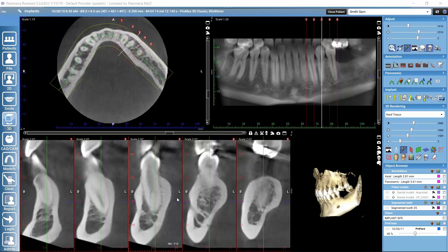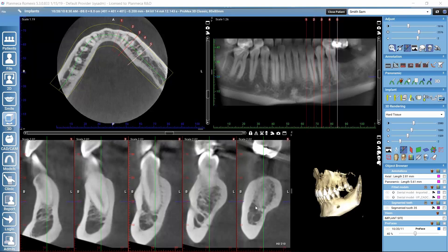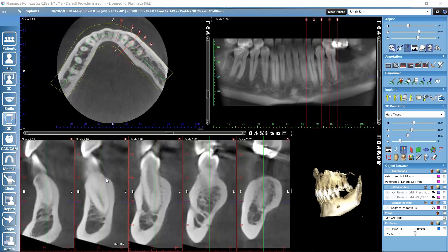Let's take a look at what kind of views we see in this sub-module. We have a panoramic view and an axial view. We can also generate the panoramic view here using the panoramic tools — for example, drawing on the axial view the plane according to which we'd like to generate the panoramic. What's special in this sub-module are these cross-sectional slices, and naturally we also have the 3D rendering.